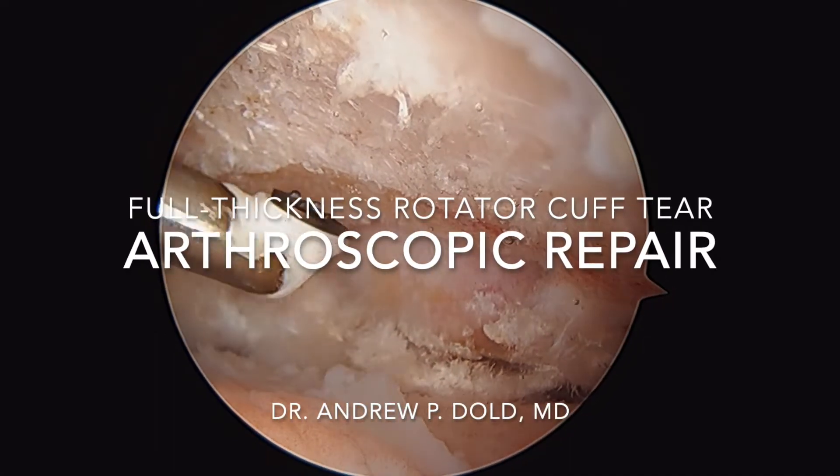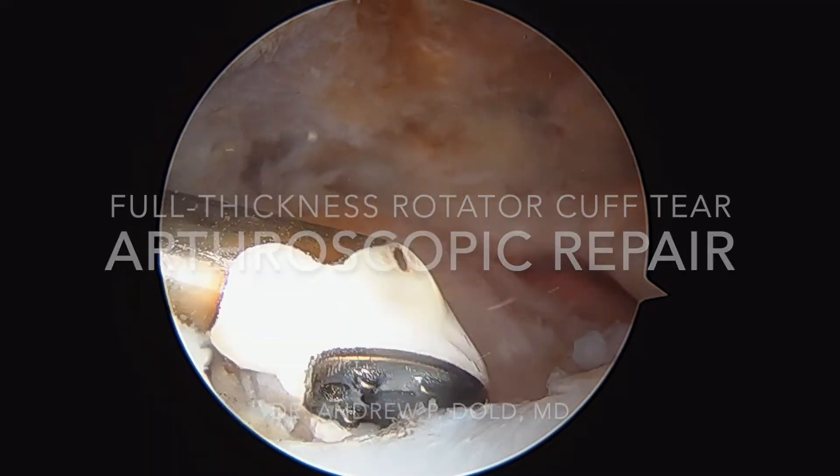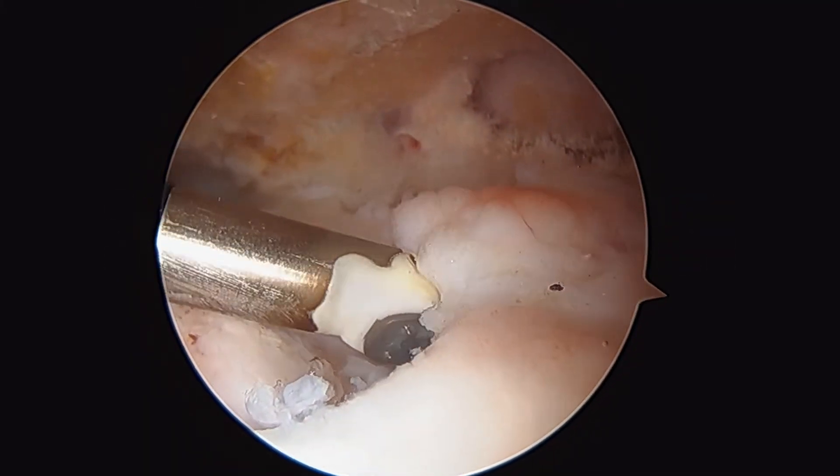We're in this patient's shoulder. This is the subacromial space. Above us here is the acromion. This is the humeral head right here. And this is what a full thickness rotator cuff tear looks like.